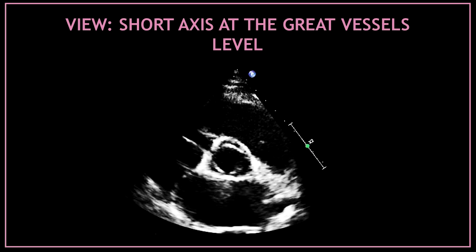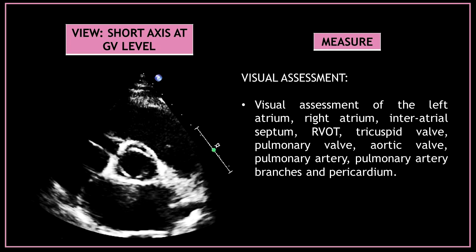Next we have the parasternal short axis view at the great vessels level. First obtain this view and then do a visual assessment of all the structures visualized. Analyze what you see regarding the left atrium, right atrium, interatrial septum, right ventricular outflow tract, tricuspid valve, pulmonary valve, aortic valve, pulmonary artery, pulmonary artery branches, and pericardium.